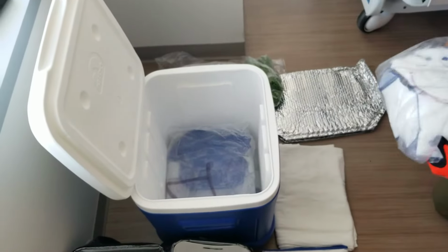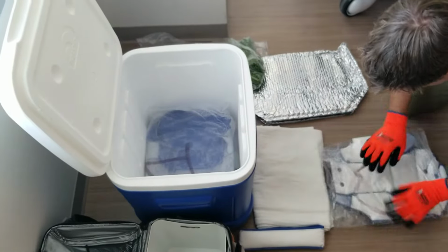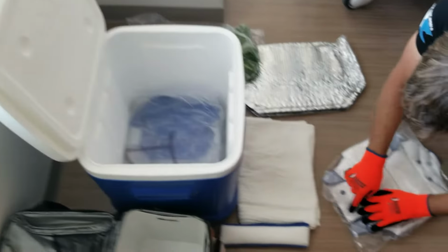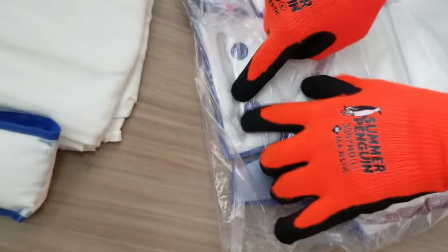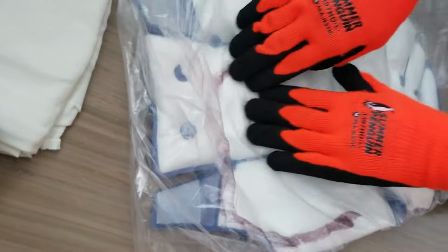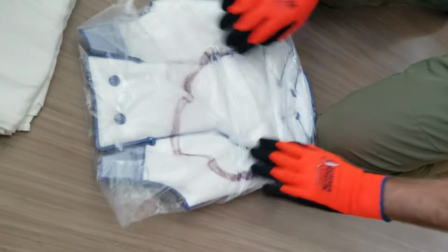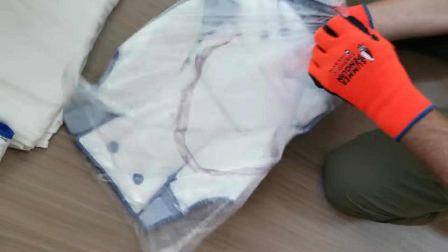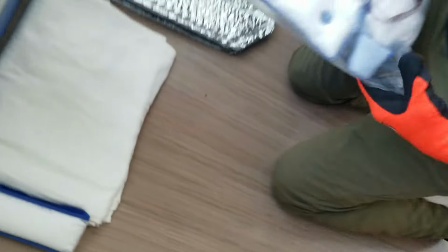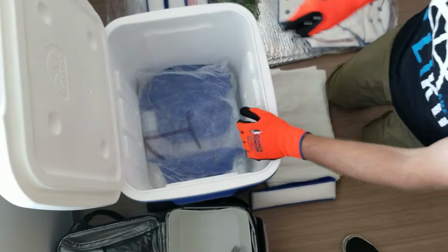Okay, this one was labeled, but I don't even pay attention to what number I have. And something you want to do, especially in the front here, you'll notice the gel has been kind of lifted there, so you want to massage it back in, because if you don't do it now and it freezes, you'll never get it in there. The whole point is to get good coverage. So now that I got that bag ready to go back, this one's going to go in the bottom of the cooler.